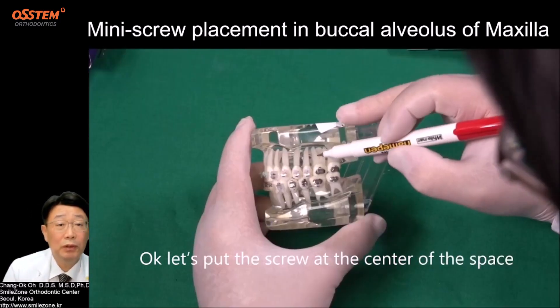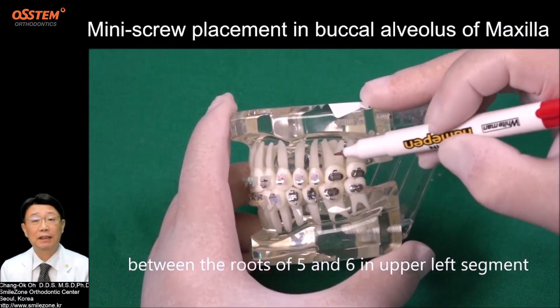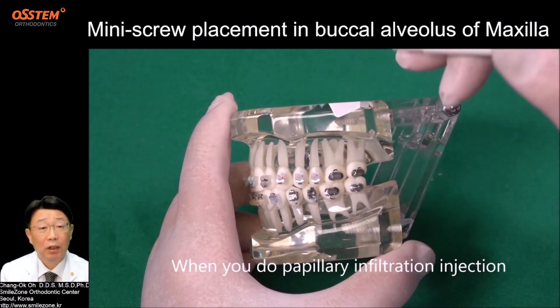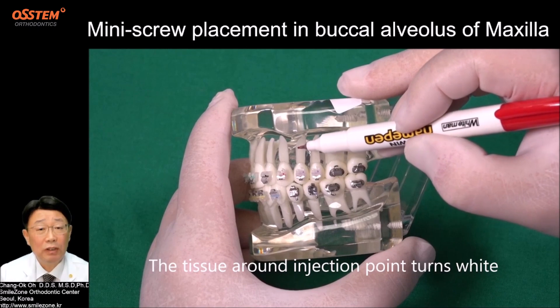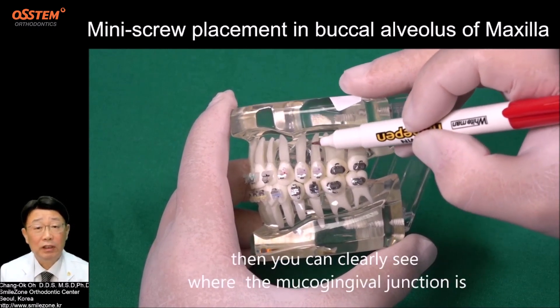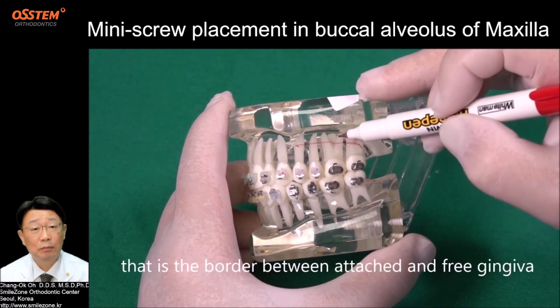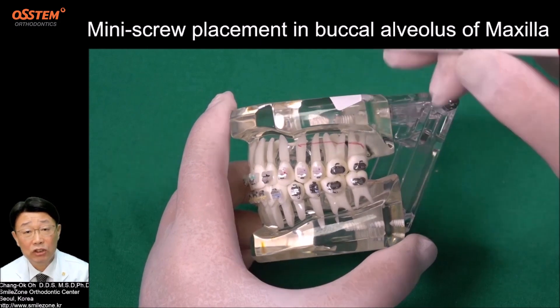Let's put the screw at the center of the tube, in the space between the roots of teeth 5 and 6 in the upper left segment. When you do a palatal infiltration injection, the tissue around the injection point turns white. Then you can clearly see where the mucogingival junction is — that is the border between attached and free gingiva. This is attached gingiva.